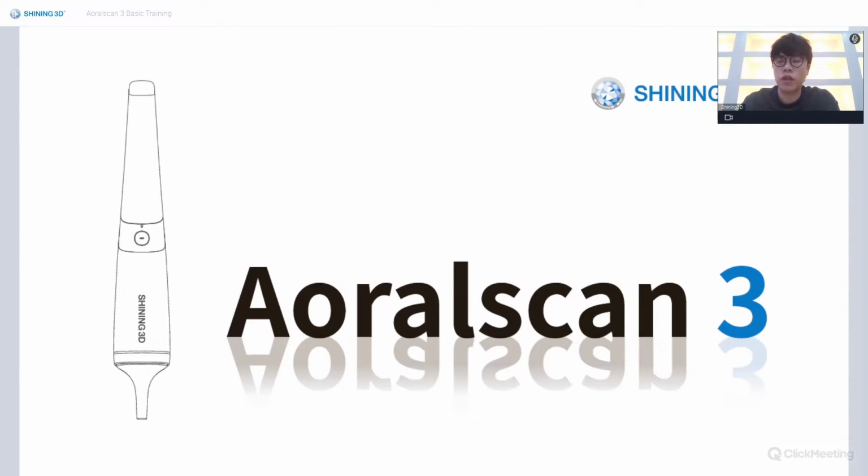This is Victor from Shining 3D, and today this webinar will talk about the basic operations of our latest intraoral scanner, Aoralscan 3. So let's begin.